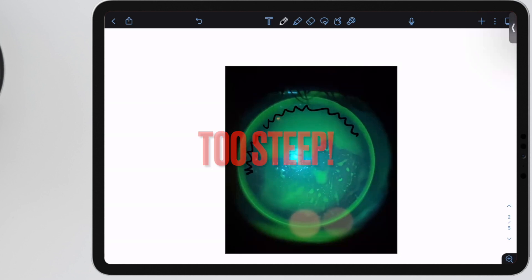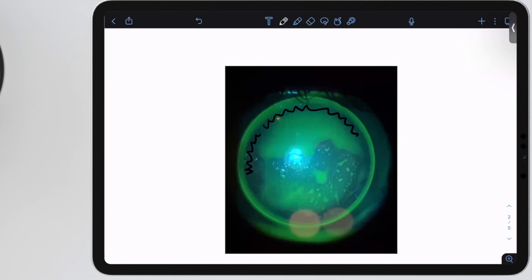If you look at this picture, what else is going on with this lens? Yeah, that wetting is terrible. You see all those little pockets of fluorescein on the surface of the lens. How do you fix this? You can add coatings to the front of the lens or change the lens material.